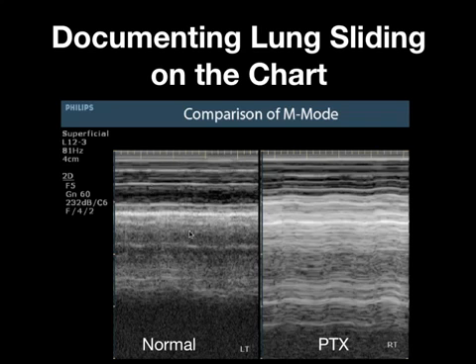However, when you look into the pleura, you can see that there's this gritty or sand-like appearance. Liechtenstein refers to this as the sandy beach sign or the seashore sign. This grainy appearance is due to the movement back and forth, and that could be used to confirm that yes, there was movement present. And since you don't see that same grittiness or graininess in the subcutaneous tissue, you know that wasn't due to motion artifact.